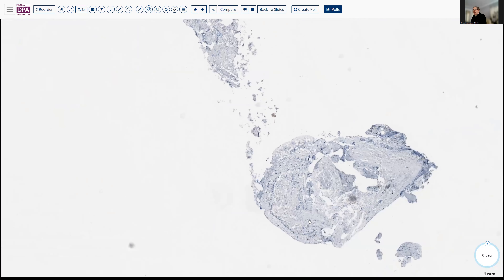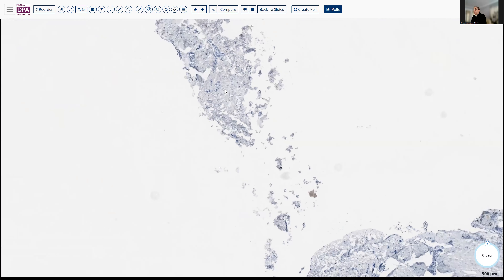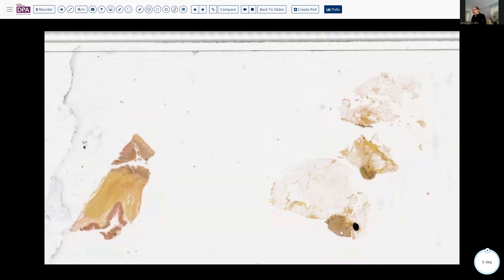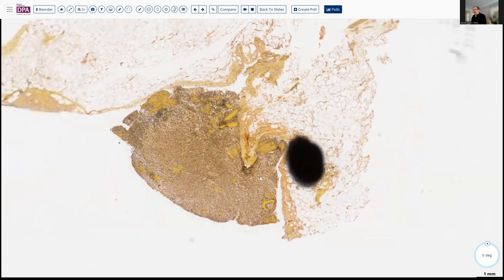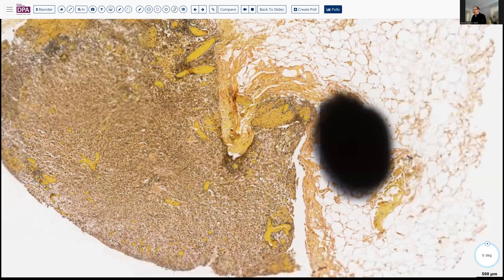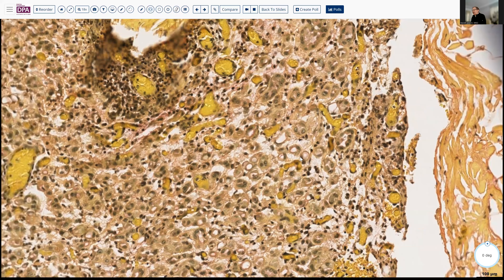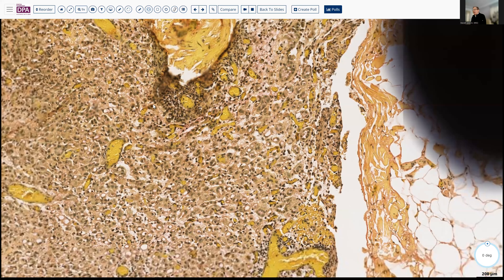Here's an example of some staining results. As you can see, we have minimal identifiable tissue remaining in this sample that was stained with CEA. We were able to identify the cytokeratins. And it looked as though on the mucin carmine we had sufficient sample remaining. My colleague has highlighted an area where we have these nice rounded signet spaces, and it looks like there may be just a hint of mucin in this little vacuole — it's not very striking, it's kind of iffy. But on that basis, with a limited sample, we made the diagnosis of adenocarcinoma, uncertain primary.